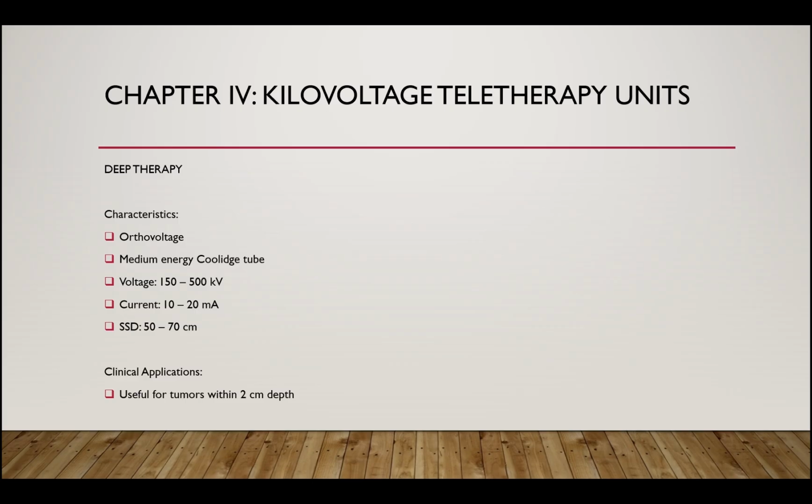So, the deep therapy or orthovoltage therapy is used for tumors within 2 cm depth. So, medyo malalim na yung kaya niyang i-treat. But we have to realize that the maximum dose occurs close to the skin surface. Okay? 90% of the delivered dose to the tumor is absorbed in the skin surface.